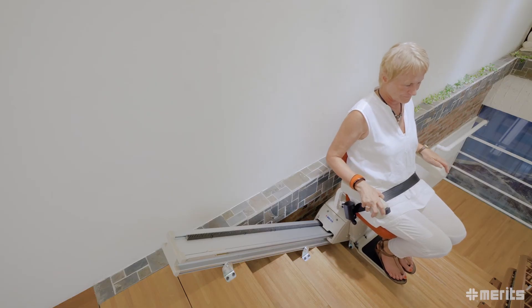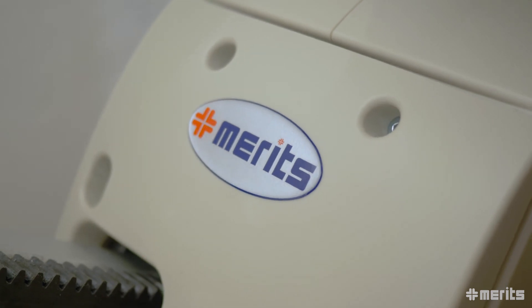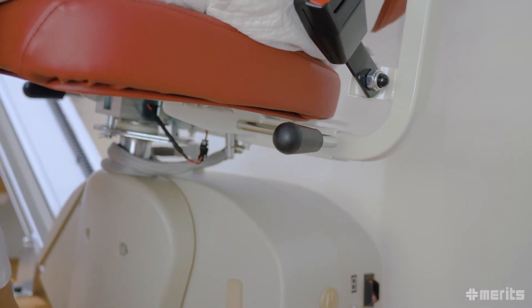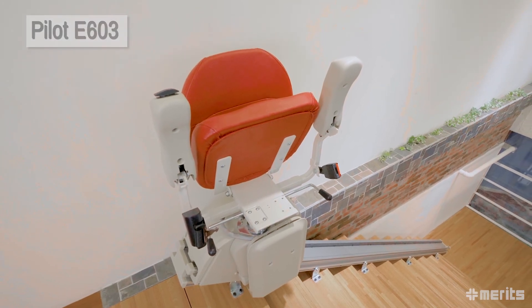Merits' Pilot E603 comes with all the right functionality needed in a stair lift. This straight track model is a truly great blend of convenience and stability. Its simple to use controls and its well-designed safety features make the Pilot E603 an excellent choice when seeking to improve the mobility for riders with straight staircases.